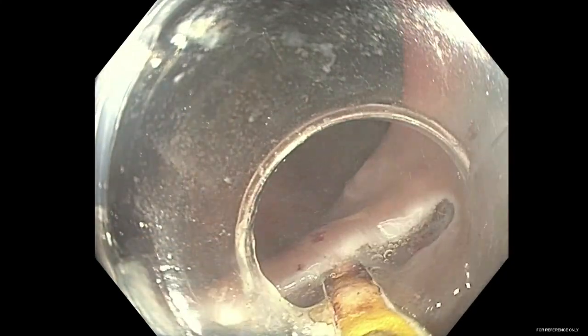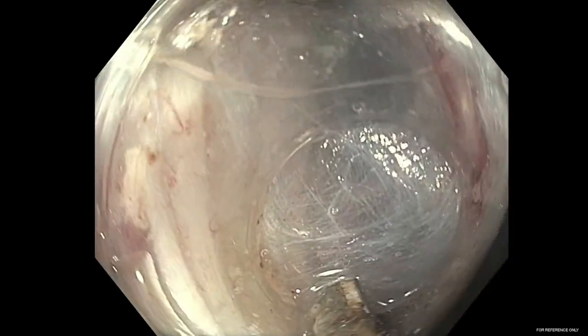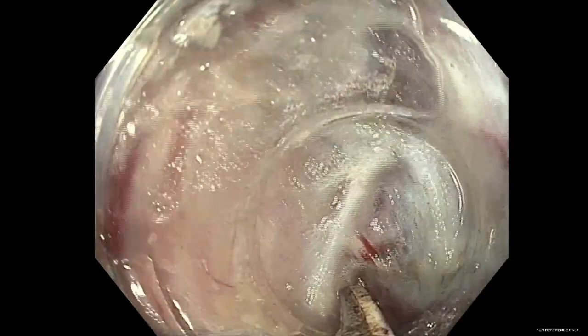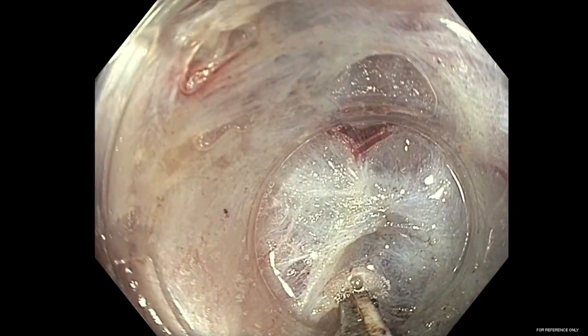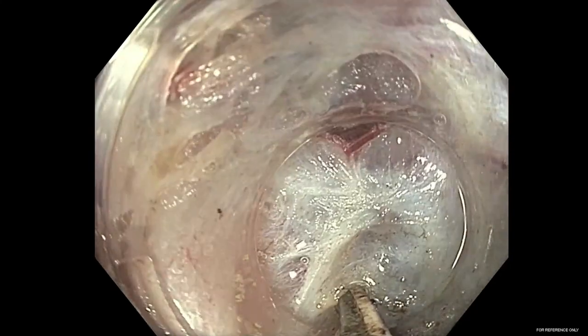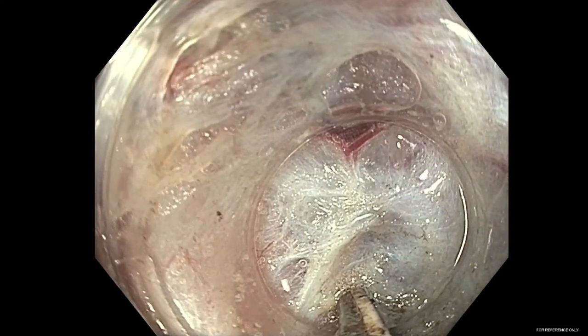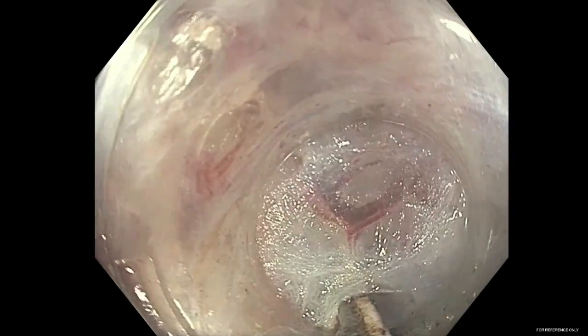As you can see in the video, submucosal dissection has begun, noting specifically that the base of the bipolar radiofrequency and microwave-powered device is insulated and resting against the muscularis propria to avoid muscle injury. The knife is moved horizontally using radiofrequency energy to perform dissection, with preemptive coagulation of vessels performed using 10-watt microwave coagulation.